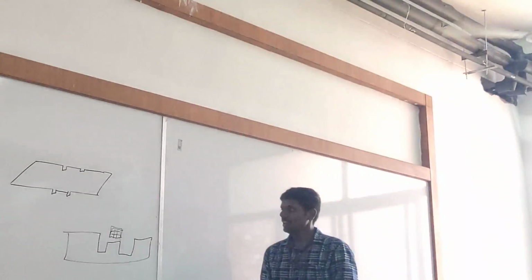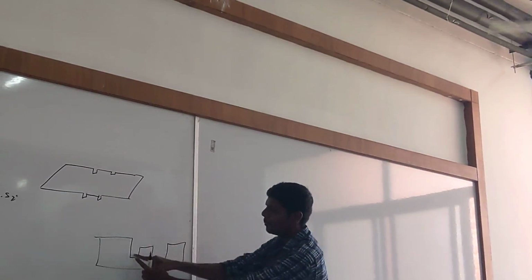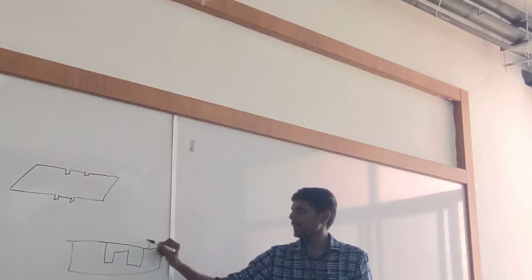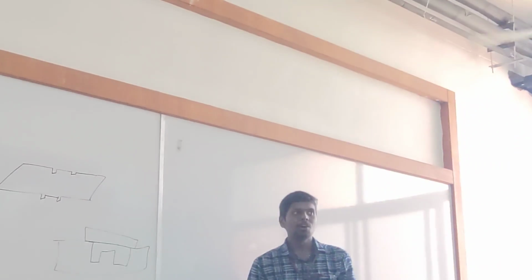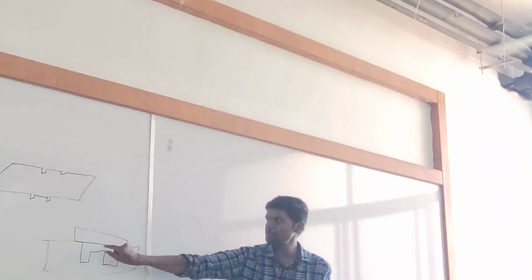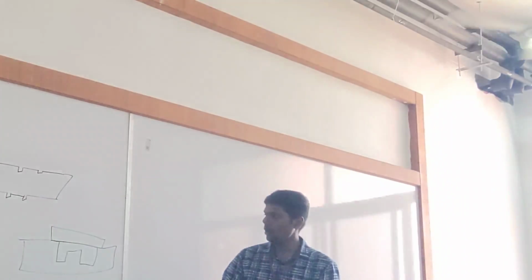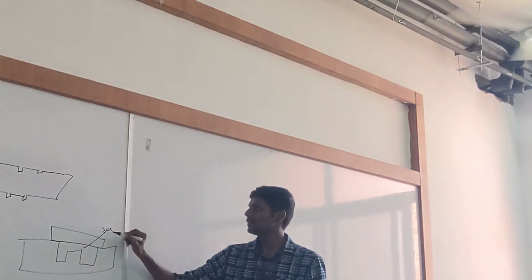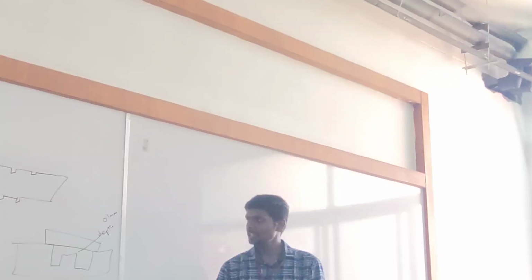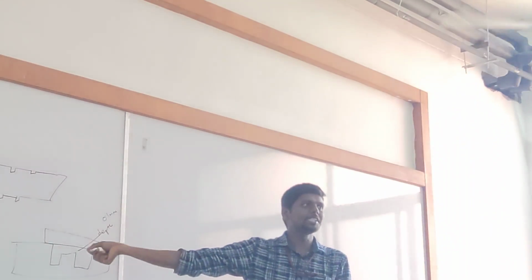The grid is available here. So what is the purpose of these two areas on both sides? Here we will keep a cover slip. Between the cover slip and the Neubauer chamber grid, there is a space. This space is the depth of the Neubauer chamber. And what is the depth of the Neubauer chamber? 0.1 mm. In between this space, RBC will be suspended.